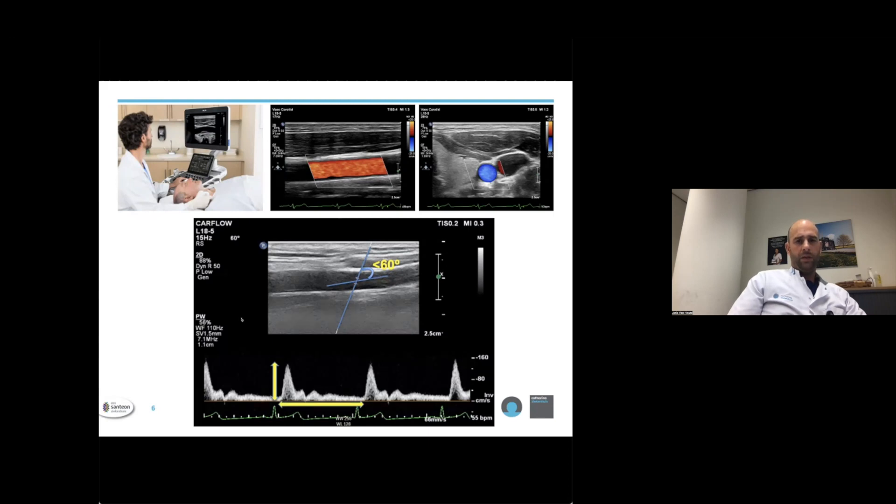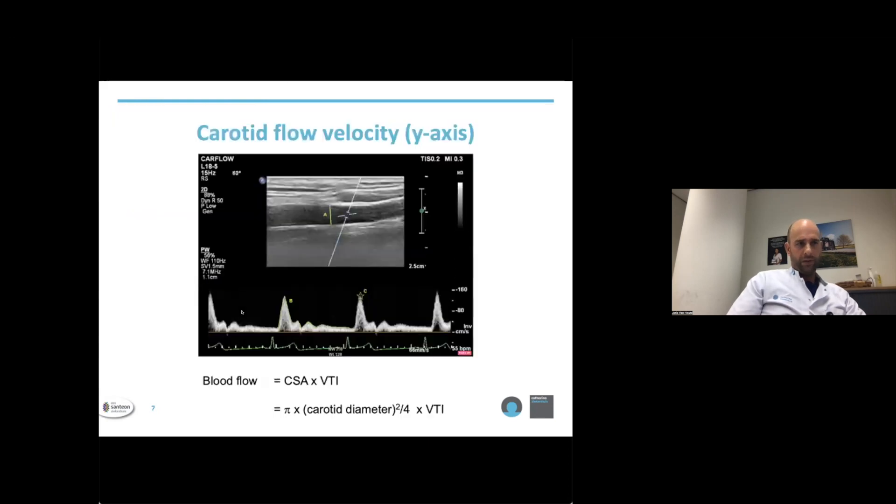Looking at the y-axis, blood flow velocities can be measured as a maximum velocity, as marked by C in this picture, or the velocity time integral, as marked by B. From the carotid artery diameter, the cross-sectional area can be calculated, which, multiplied by the carotid velocity time integral, gives us the unilateral carotid blood flow.